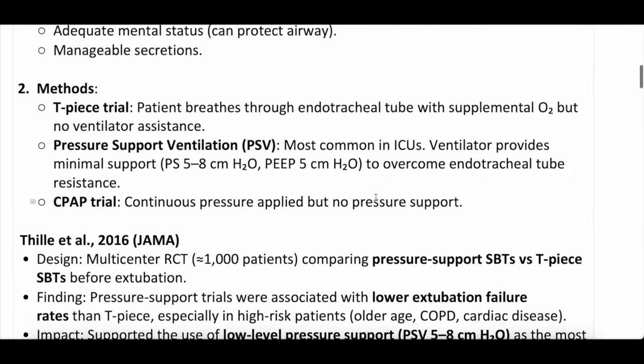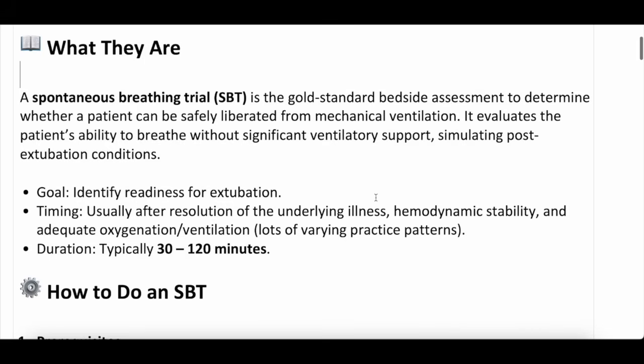And with no further ado, spontaneous breathing trials. So what are spontaneous breathing trials? Well, a spontaneous breathing trial, as many of us know, is kind of the gold standard bedside assessment tool to determine whether a patient can safely be liberated from mechanical ventilation, right? So it's an evaluation of the patient's ability to breathe without significant ventilatory support, right? A way to simulate extubated conditions as a way to understand if a patient might be ready to be liberated from mechanical ventilation.